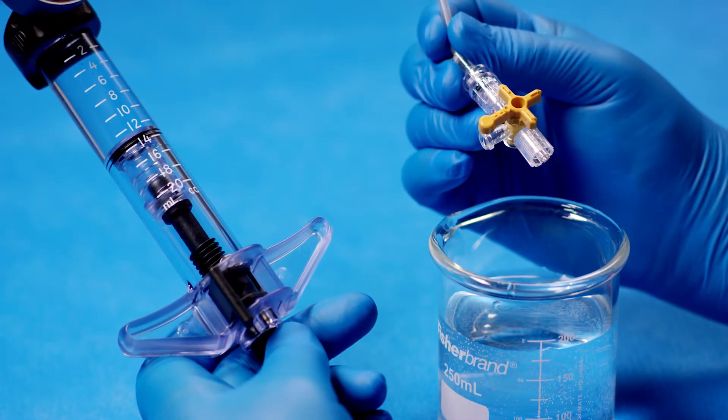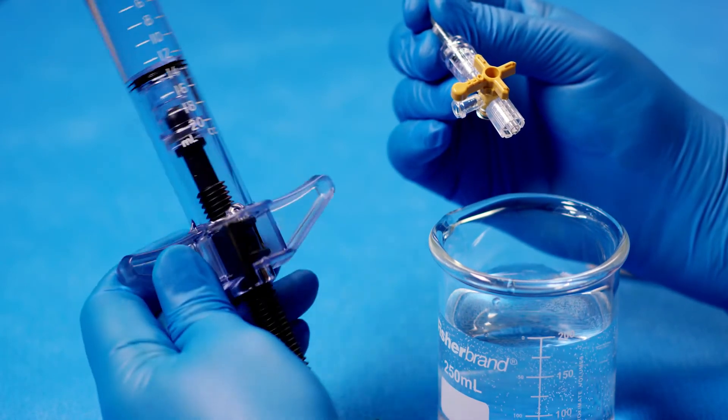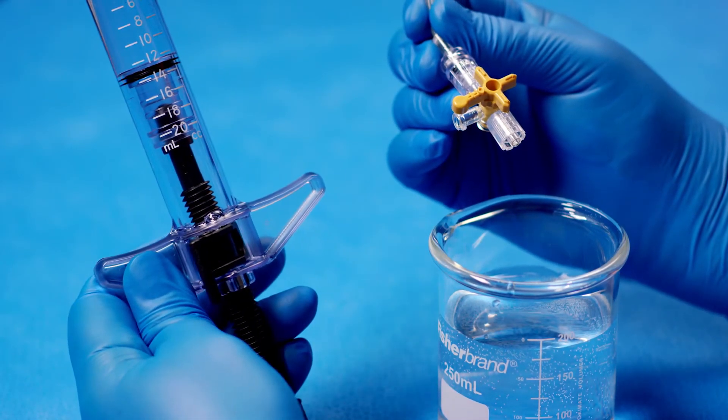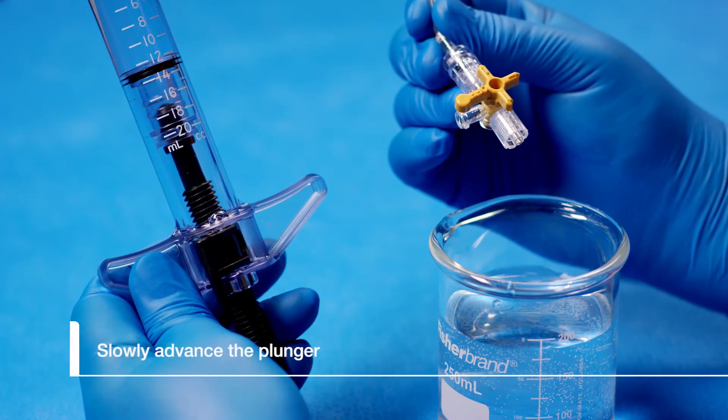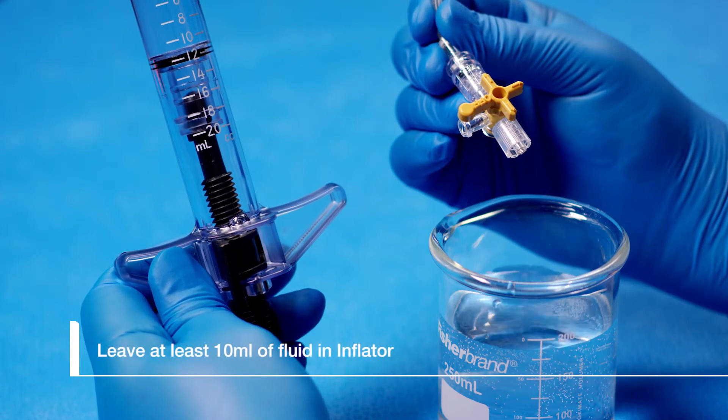Next, we will remove air from the inflator. Turn the inflator upright. Ensure the locking switch is still in the left position and slowly advance the plunger until all of the air is expelled from the inflator and catheter.